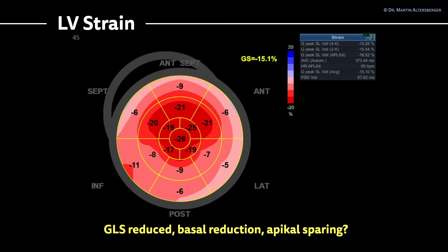There is so-called apical sparing — the sparing or normal function of left ventricular longitudinal strain in the apical regions, shown by darker red colors. The in-between reddish colors represent just the gradient. The basal segments have reduced function, while the apical segments appear to work normally and have normal longitudinal function.